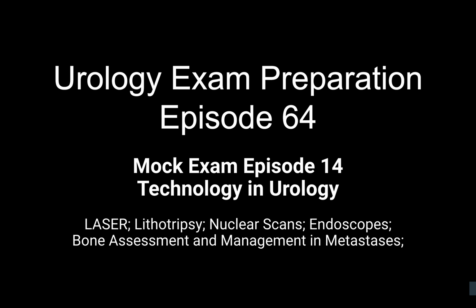Okay. Is there any other significant side effect noted during the procedure with thulium fiber laser compared to holmium? With thulium, there is production of a distinct charring effect on the stone, but that is all I'm aware of. Okay. Is it possible to use these lasers in tissues other than stones? Yes. The holmium YAG laser is very commonly used for holmium enucleation of the prostate.